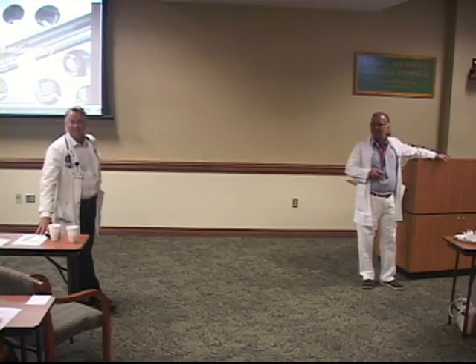Any other questions? Back in '96, you took a pituitary tumor off my brain. If it happened today, is this the procedure you would use? It depends. If it came up today and we had enough clearance between the tumor and the optic nerves, which are very sensitive to this kind of radiation, we might very well treat it with the Gamma Knife. Yeah, that's good.